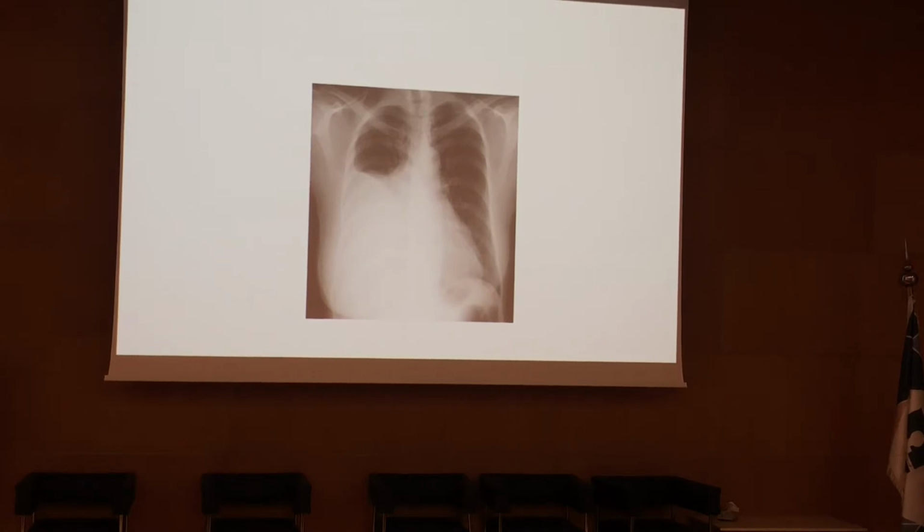So this is a fluid. So it's either blood or just clear fluid. We call this pleural effusion. Okay, pleural effusion. So pleural effusion cannot differentiate what type of fluid this is in X-ray. Never. So this is pleural effusion.